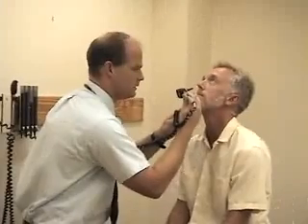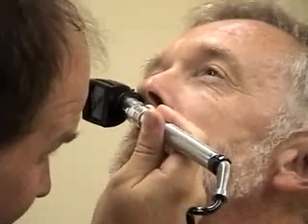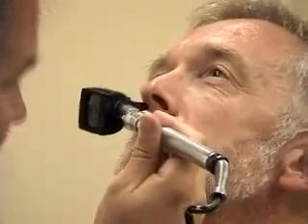I'm going to examine the inside lining of your nose now. There are special nasal specula that you can use, or you can also just use the widest ear speculum. I'm going to have you tip your head back. Now, this might tickle a little bit or make you sneeze. Okay. And I'm going to try and avoid touching the sensitive nasal septum. And do the same thing on the other side.